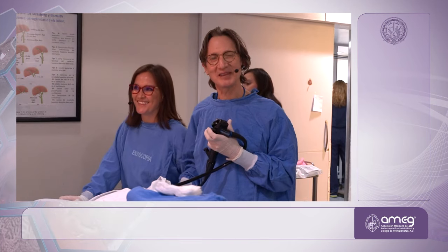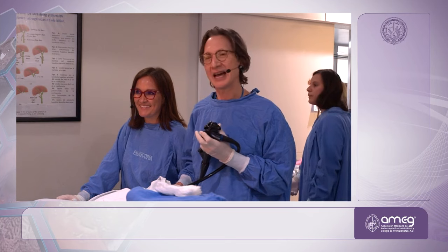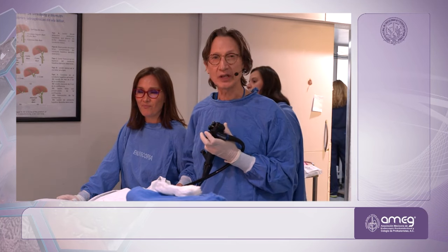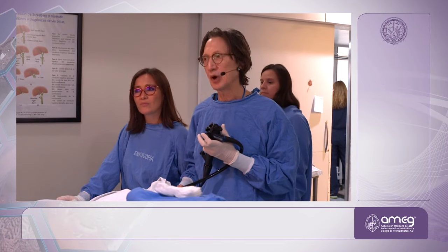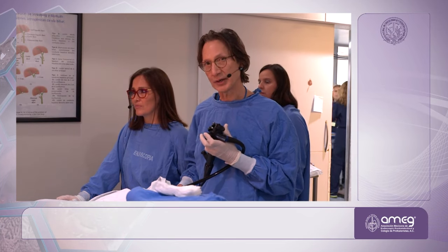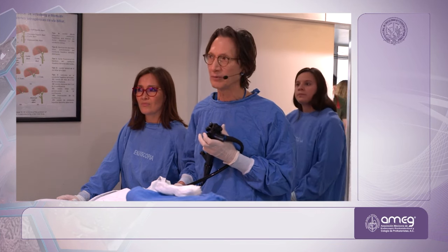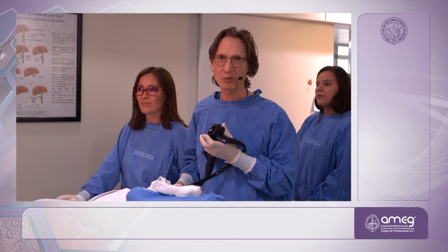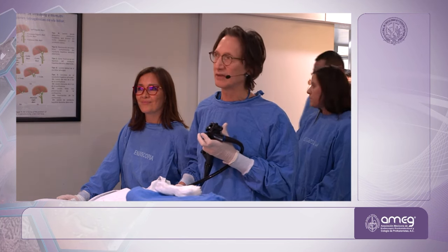We are taking a scuba diving journey into the colon, and I have just intubated using the water exchange method. So the gas is turned off, no gas, only using water, infusing water while simultaneously aspirating the water. It's saline, but we call it water. I've reached the cecum literally within just a few minutes.